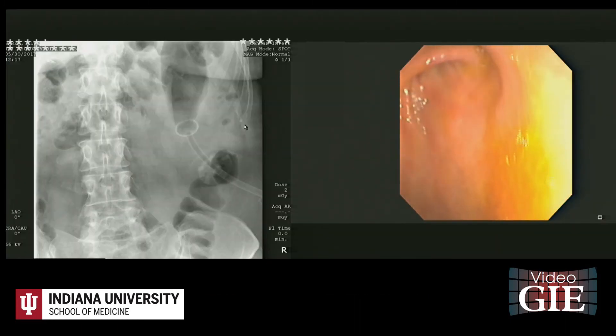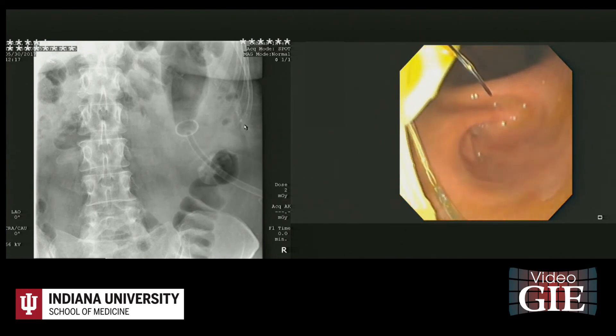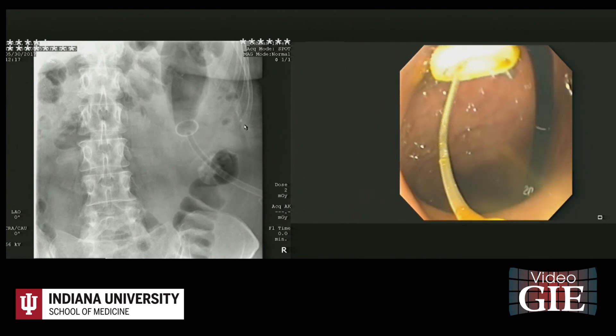A J-tube was then passed through the G-tube and advanced over the wire, placed endoscopically to the jejunum.